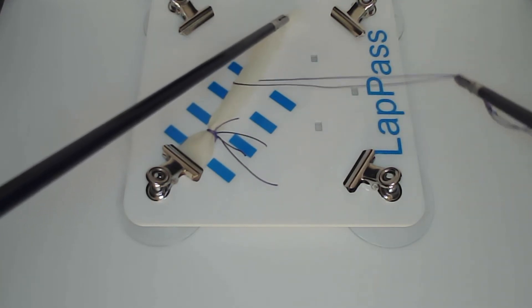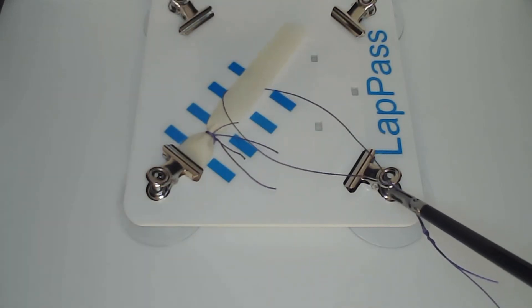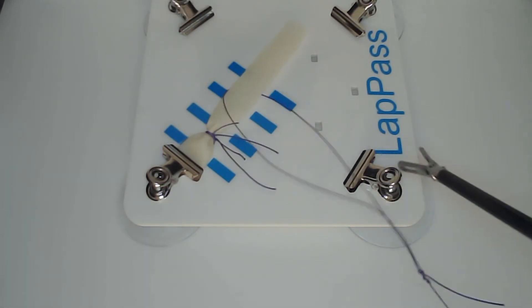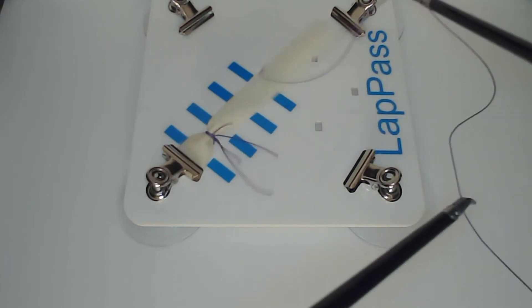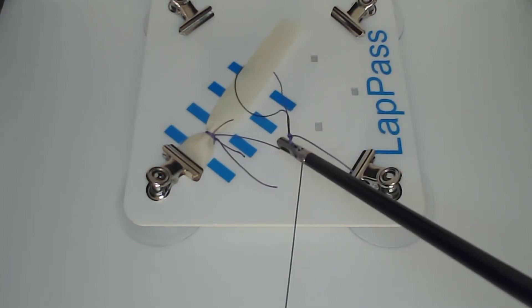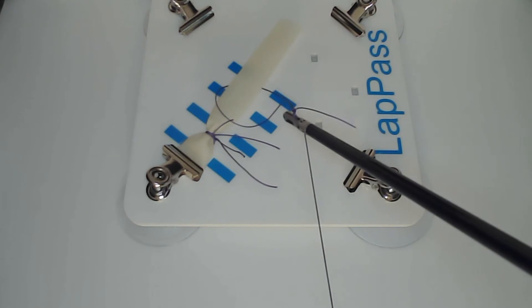I normally choose a length of braided suture about 80 centimeters. A normal loop suture creates three separate sutures.